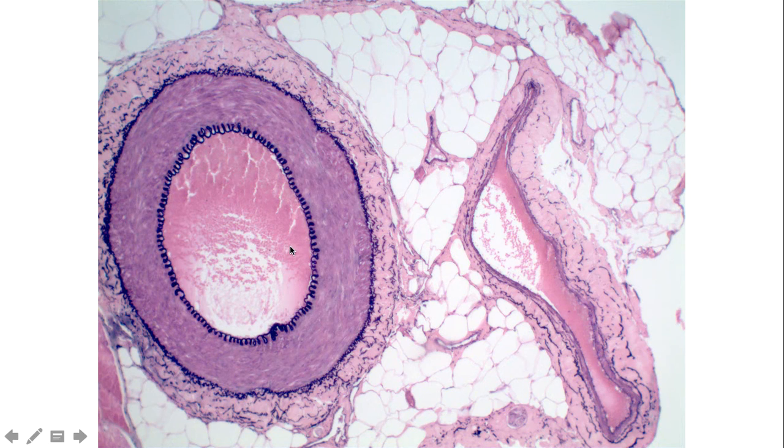And so if we shift our attention to the left onto the artery, this is going to be an example of a muscular artery. Again, we have two different types of arteries we're going to look at. There's the muscular artery that we see here, and then there's the elastic artery, which for us is going to be the aorta slide.